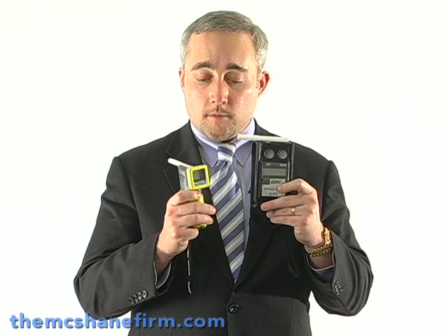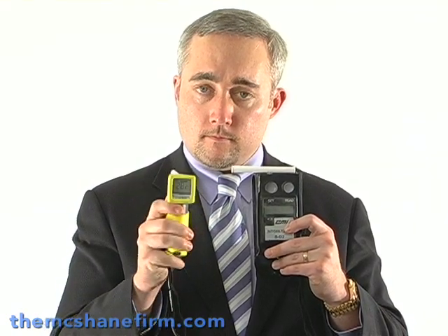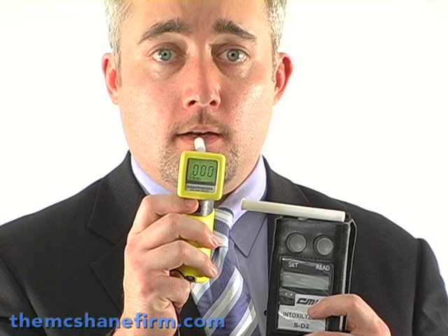So let's begin our experiment. Just to prove there are absolutely no shenanigans, I'm going to take each one of these devices. I'm going to start with the yellow one — the AlkaSensor FST — and turn it on so you can see that it's operational and working quite well. It's powered on, and it now says blow, B-L-O. Just to prove that I've had nothing to drink, I'm going to blow into this and you can see the actual result.